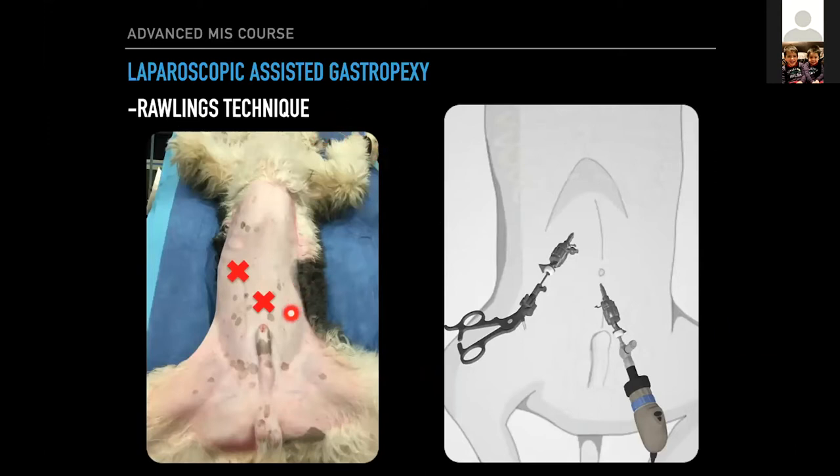Here are the port placements as Rawlings described. Sub-umbilical — whatever entry technique you choose. I do a modified Hassan, make a one centimeter skin incision, put two stay sutures in the rectus fascia, elevate, drop in a 6-millimeter cannula, insufflate the abdomen, then place my 12-millimeter port. This has to be strategic — not just popped in anywhere. It has to be in the location of where your gastropexy is going to be, just lateral to the rectus abdominis, roughly 3–4 centimeters caudal to the last rib.